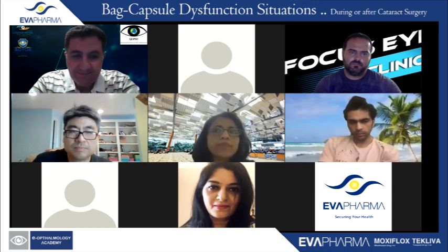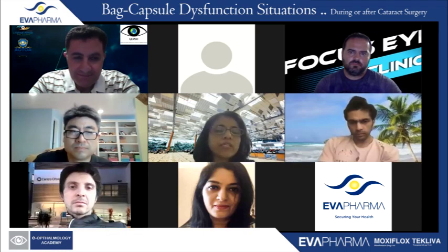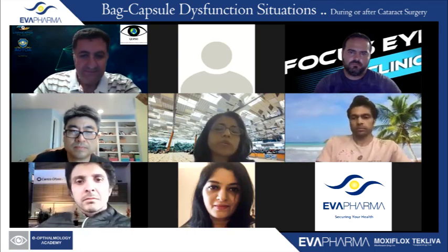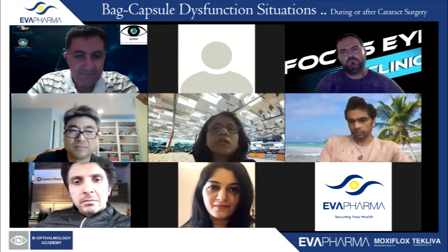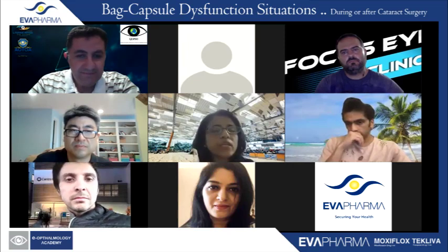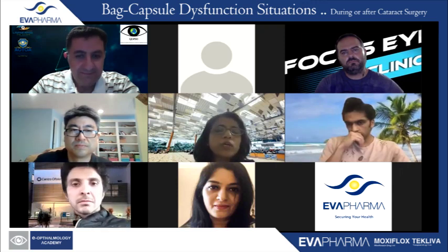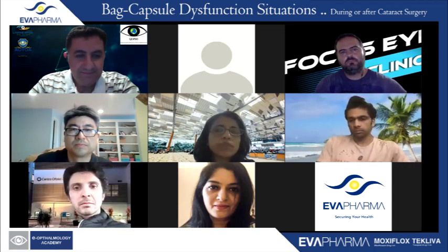But then that's something you're doing intraoperatively, and you might end up with a vitreous prolapse, which then has to be managed. So a more sensible thing would be to go in the early postoperative period, before the capsular phimosis becomes too dense and completely shrinks the bag. Once a little bit of fibrosis has started to develop, you could put cruciate relaxing incisions on the anterior capsule and also make a posterior capsulotomy, which gives you much more stable conditions in which to do this. The risk of vitreous coming out is much less when you do it in a closed chamber. So that's one thing.